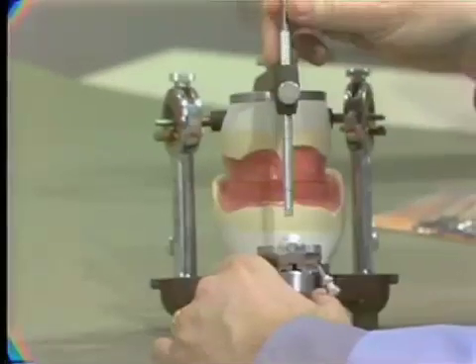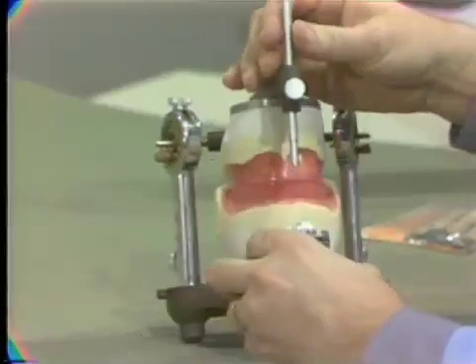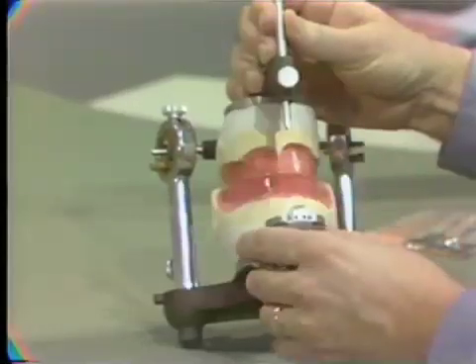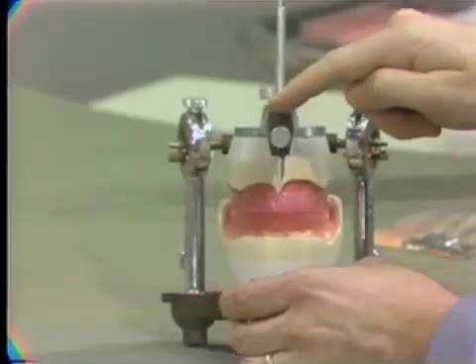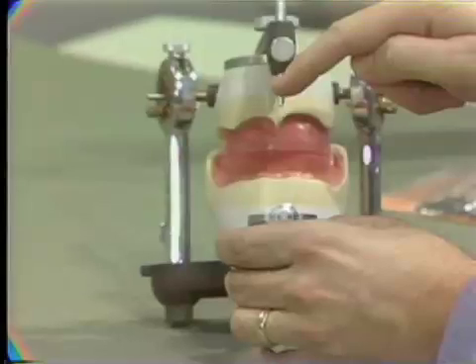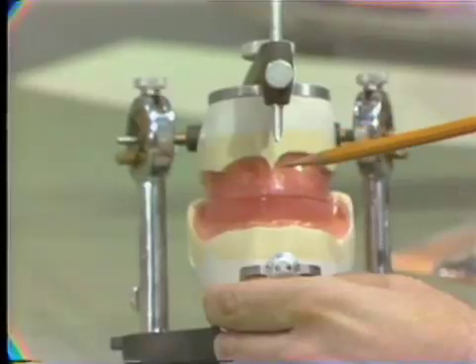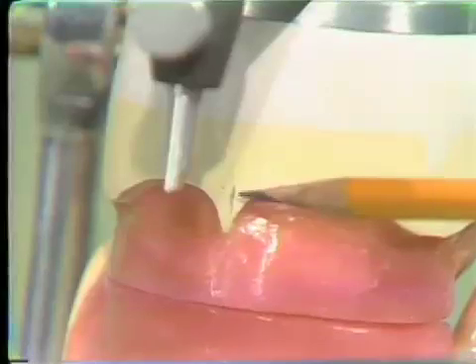We'll take the incisal pin and raise it, and then twist it slightly so the beveled edge is twisted at right angles, you see, so you have something to sight down. And then lining up the top part of the articulator with one eye, we drop down, sight through on the same line, and mark the cast. And at the same time, we will mark the wax rim for the midline. This is just an arbitrary method in the laboratory.